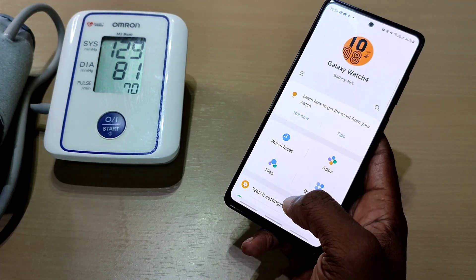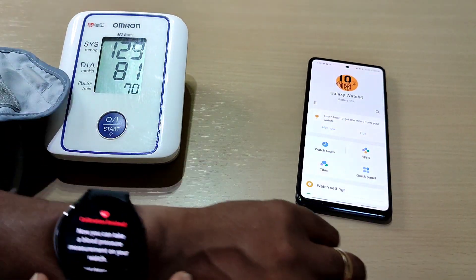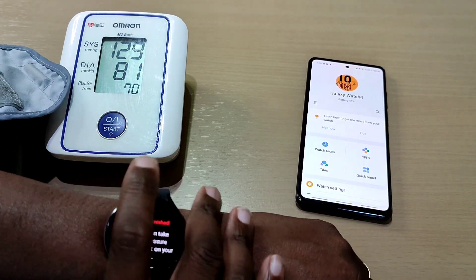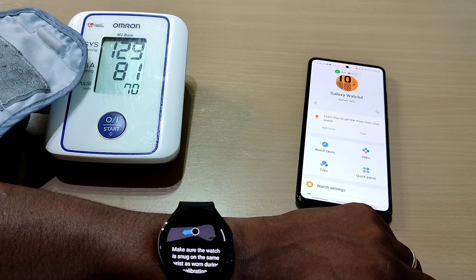I shouldn't have taken the cuff off yet — so what we'll do is take the watch measurement first. Let's measure.